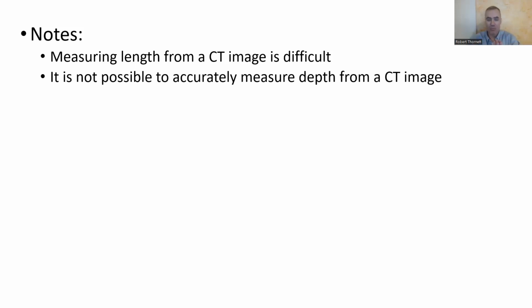But having said that, some really good hospitals, including all of the famous ones, have, for myocardial bridges, in several cases underestimated the length of myocardial bridges. So it's not an exact science. It's nobody to blame. It's just a difficult thing to do. But that's to say that I'm not making this video so we can measure them ourselves. That's not why I'm making this. We just want to know if it's there or not.